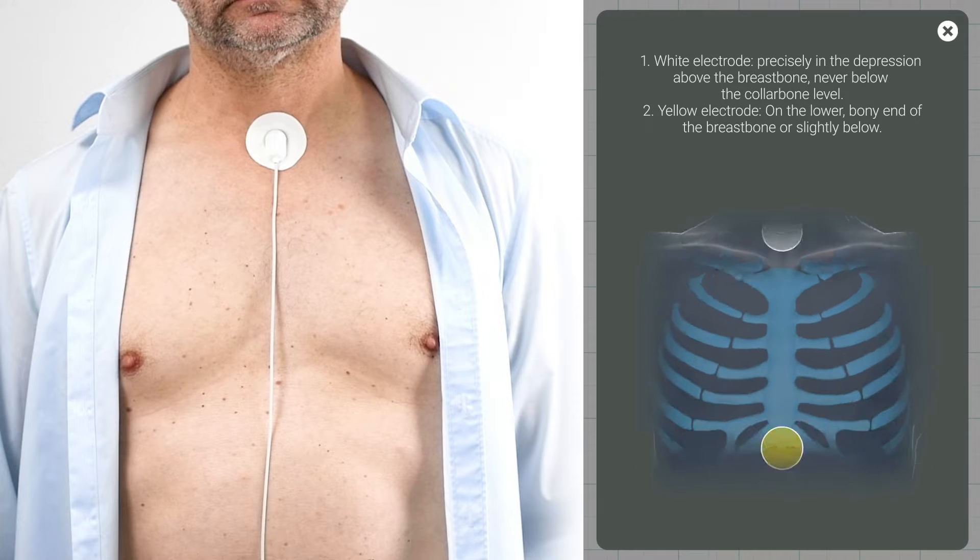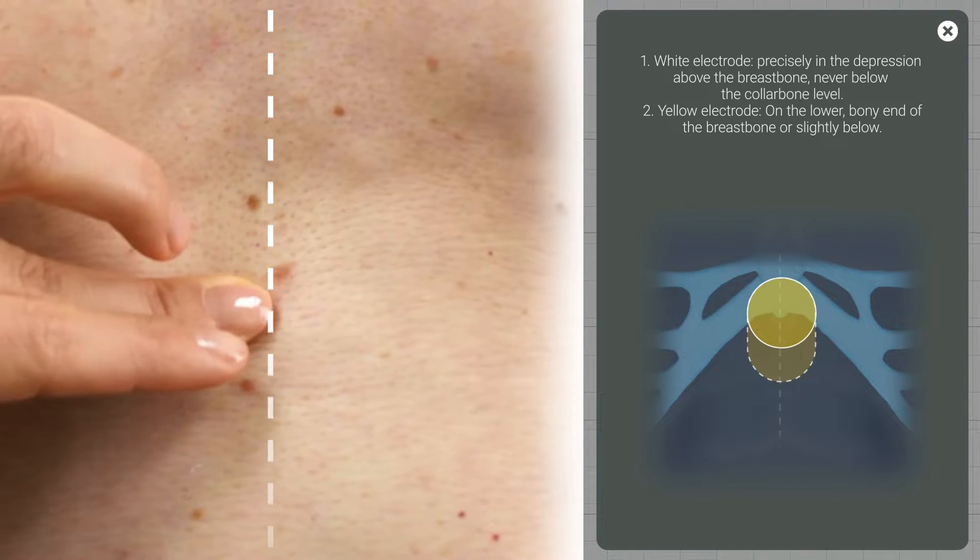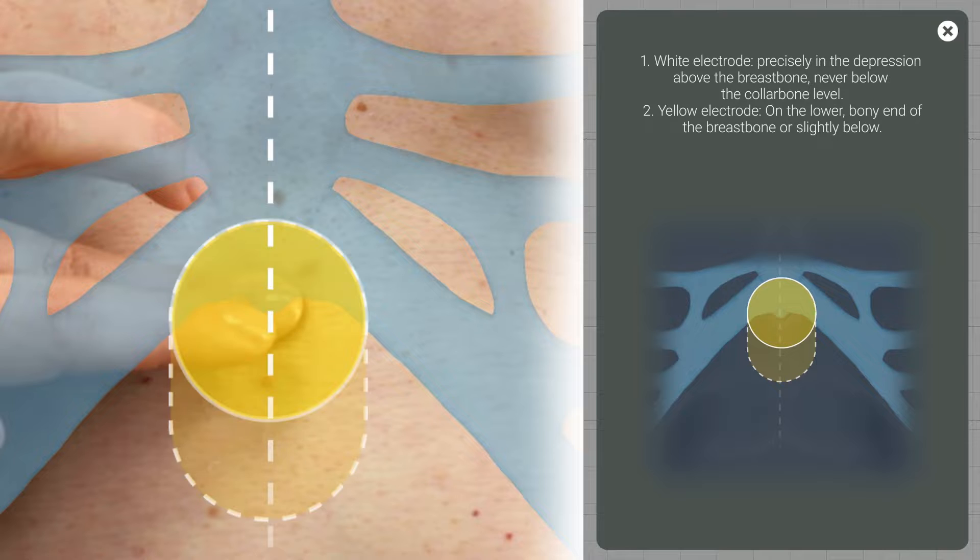Secondly, the yellow electrode on the lower bony edge of the breastbone or slightly below. The app gives you feedback on electrode connection.